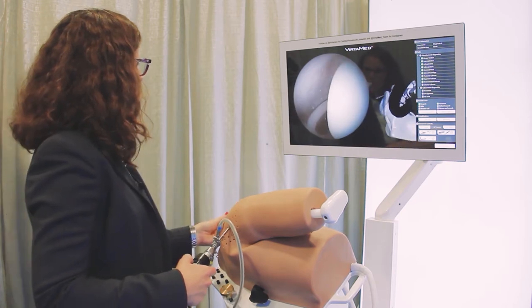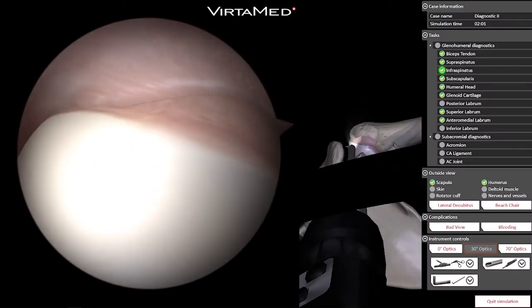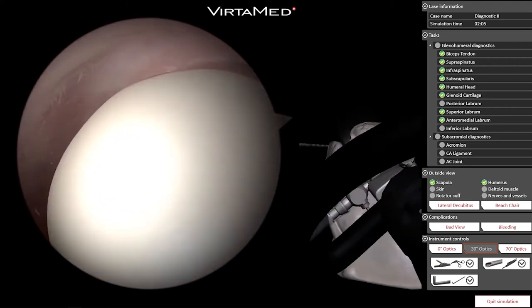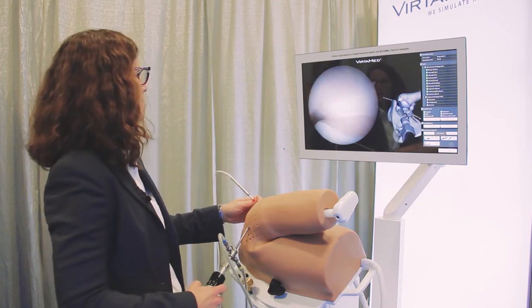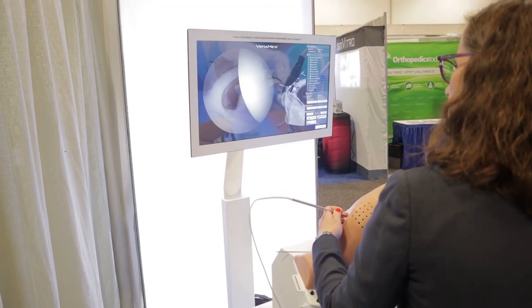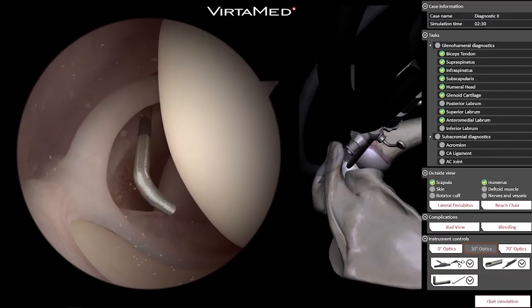Let's get the probe up there too — there's where the rotator cuff attaches at the rotator cuff footprint, and I'm looking all the way to the back. There's no obvious rotator cuff tear, just some fraying on the undersurface of the rotator cuff. There's our biceps where it attaches to the superior labrum.